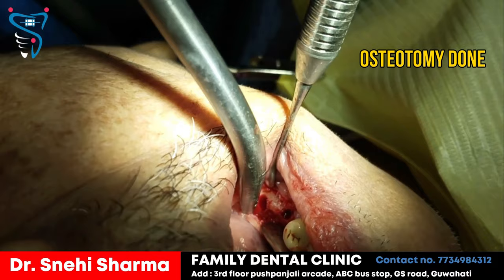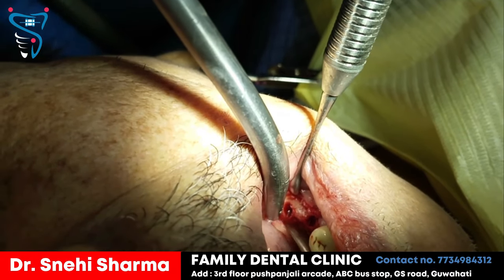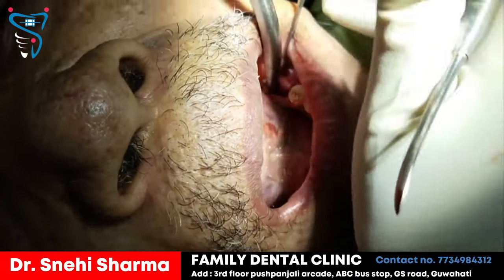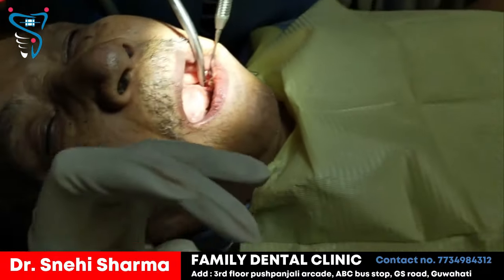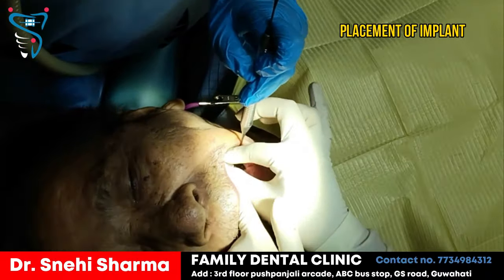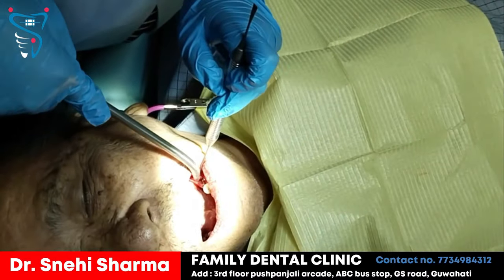We created osteotomies of 4.2 by 11.5 and 5 by 8. We will be placing two implants the same way that we placed the first two — two more implants here.